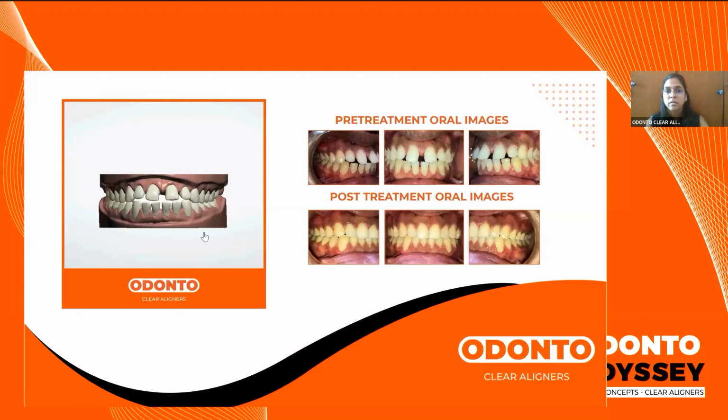The program then will be more in depth, wherein we will explain the mechanics of it, how the movements take place, the kind of movements which go well together. We call them synergistic movements. Then we have antagonistic movements. Like if you're trying to close spaces and if you are trying to correct rotations, do they go well with each other? Or you need to first correct the rotations, then go in for closure of spaces. So all these concepts will be explained in detail, and that is how we progress with the aligner program.